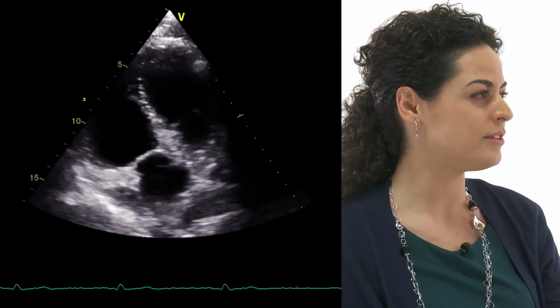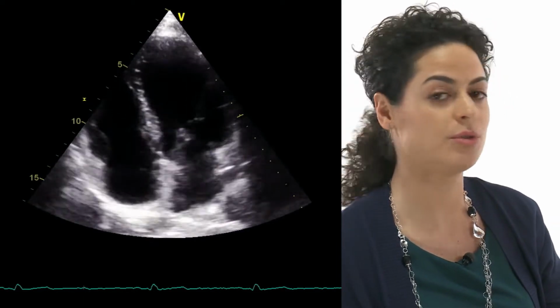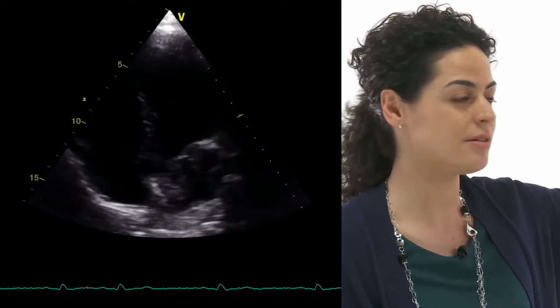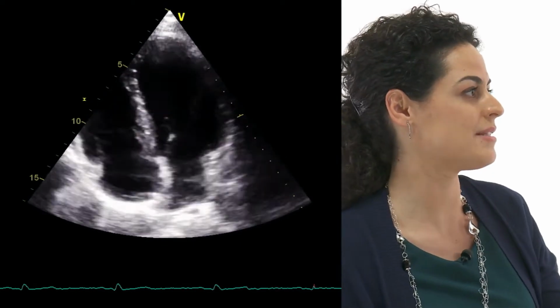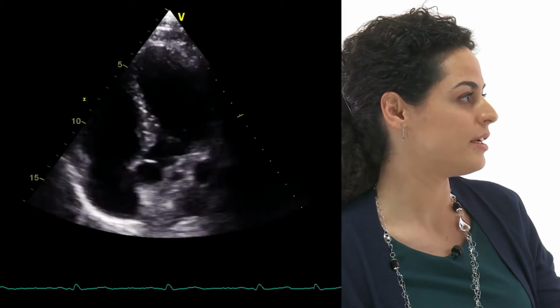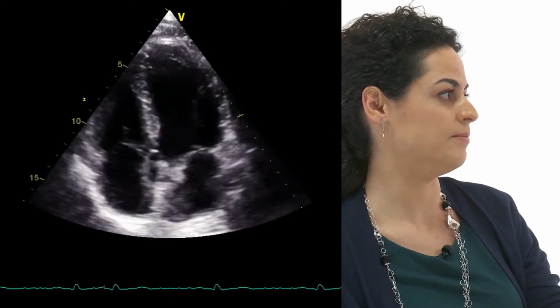We already talked a little bit about foreshortening. This happens when your transducer is too cranial, so your ventricle looks more round. And this is not a good ventricle. It's good to estimate left ventricular function, but still, when you want to measure, it's better to have a better image by moving the transducer caudally.